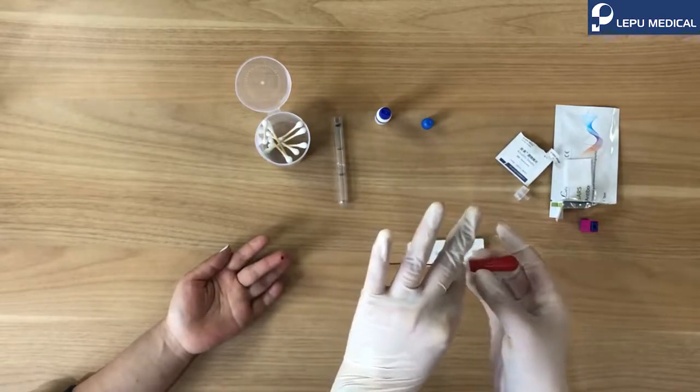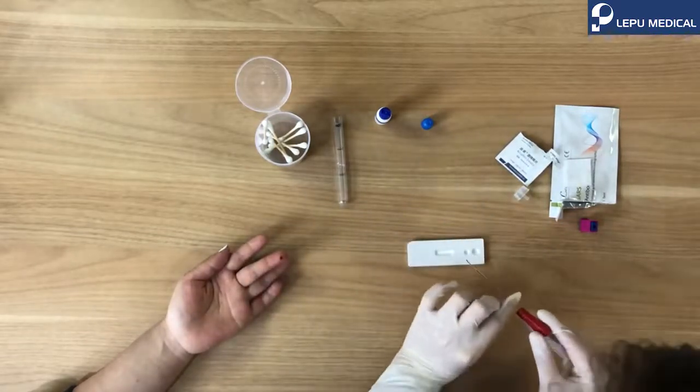Connect the pipette with dropper head and squeeze slightly into sample well A.